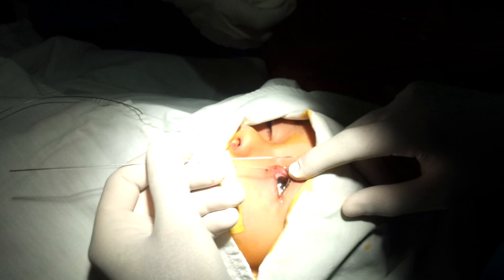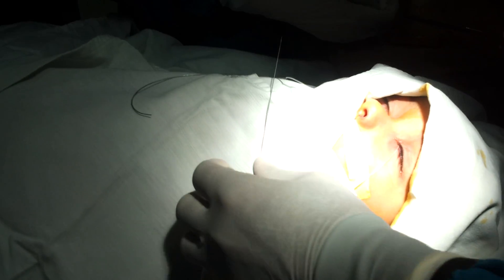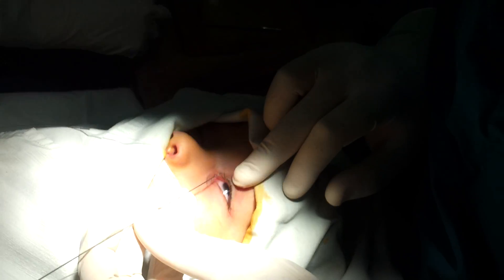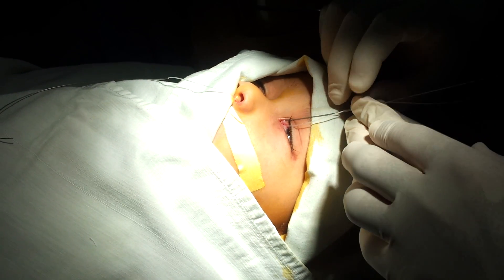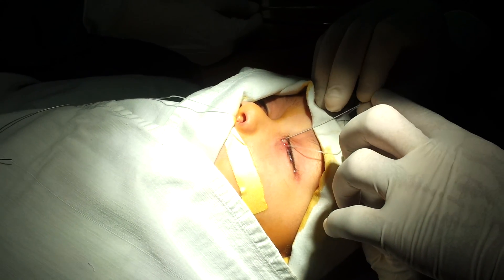Now we are going to have one of our colleagues try his first intubation. He will do the upper canaliculus. You go the first two millimeters vertical, and then you pull the whole lid lateral, and then you go medial. Then you let go your hand and guide down. Let the wire take its course without leading it — don't lead the wire, let it go by itself.